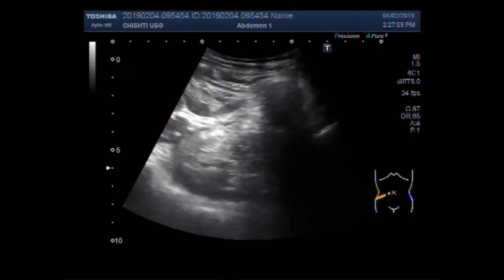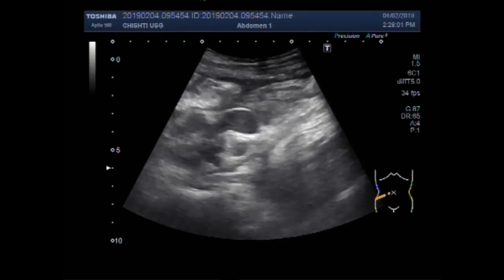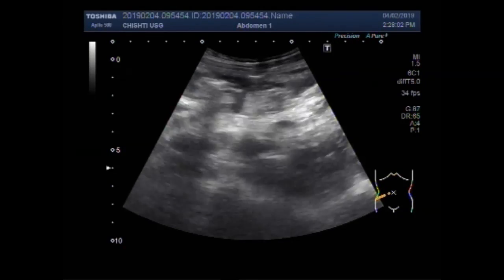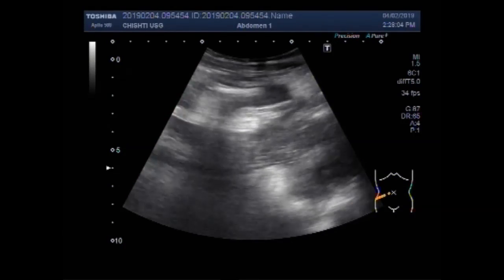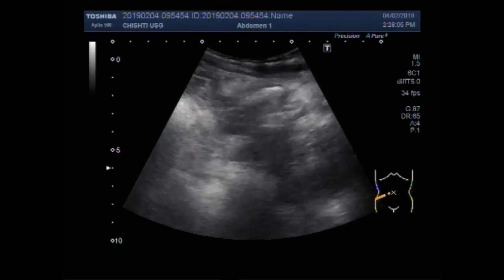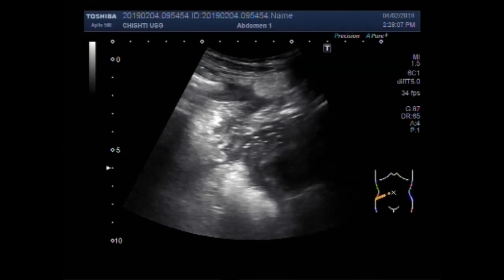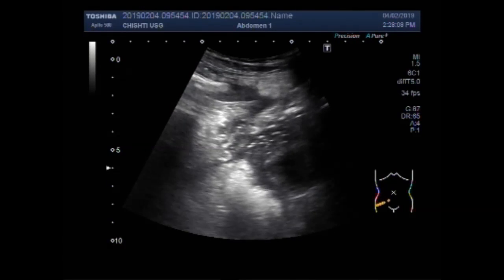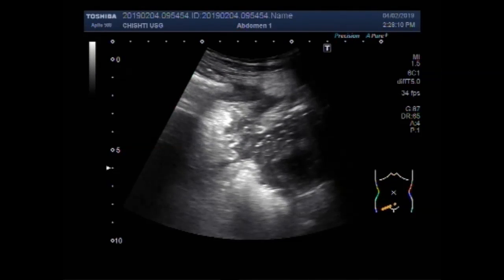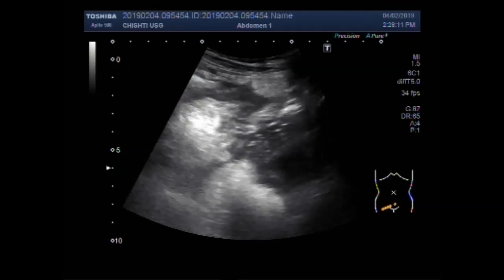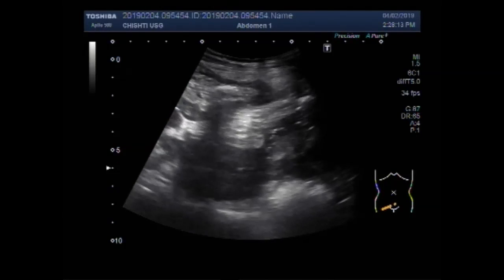You can see the gut movements are missing. There is no intestinal motility. Free fluid is seen with thick-walled gut loops.